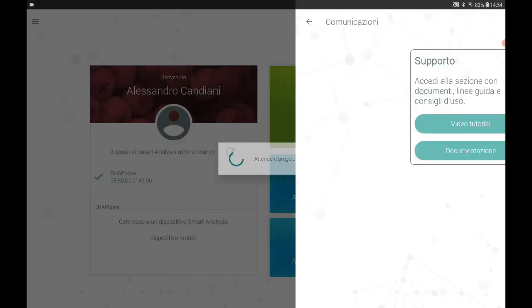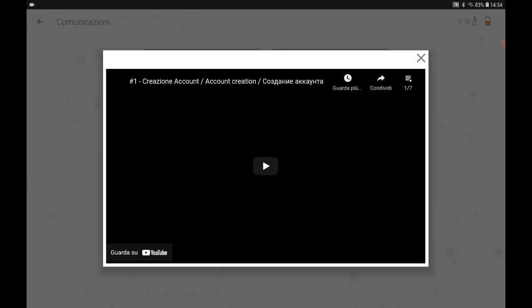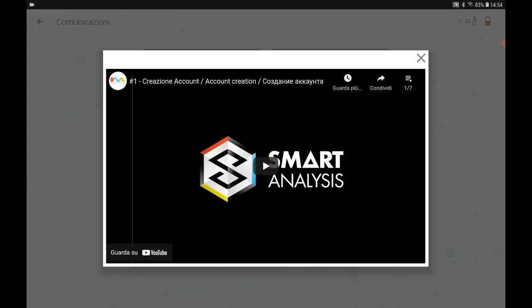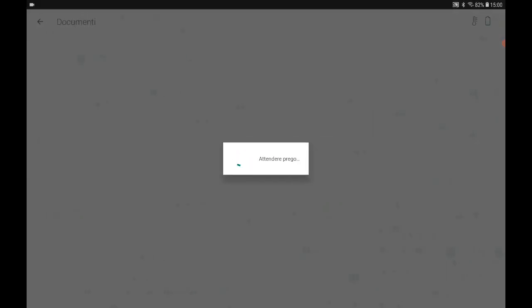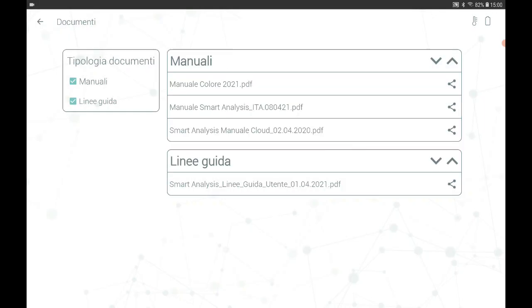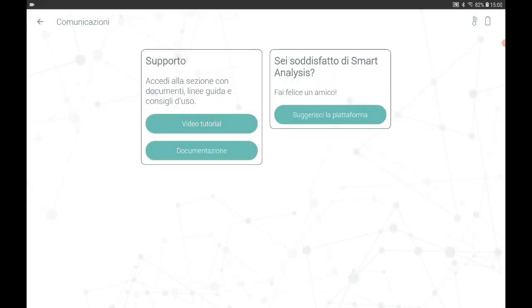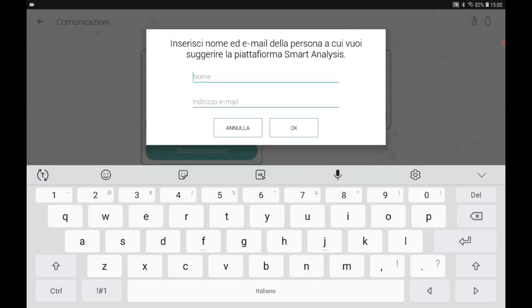In the communication section you will find links to the video tutorials, so at any time you can go and watch the video tutorials that interest you. You will find all the documents, manuals and guidelines you need to carry out the analysis without making mistakes. On the right you will find a button that allows you to suggest Smart Analysis to your colleagues or friends who may be interested in our solution.